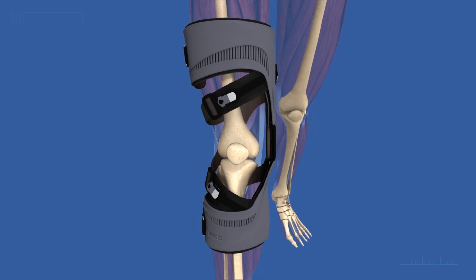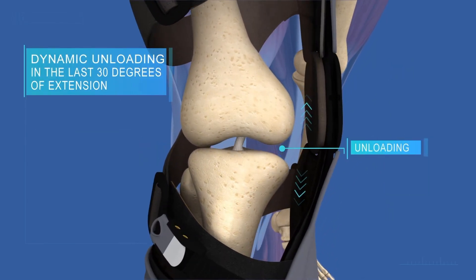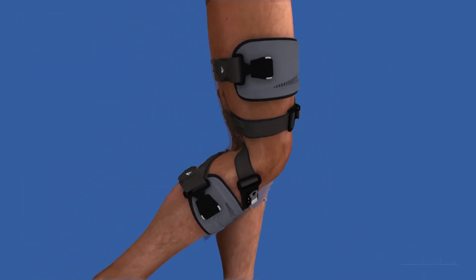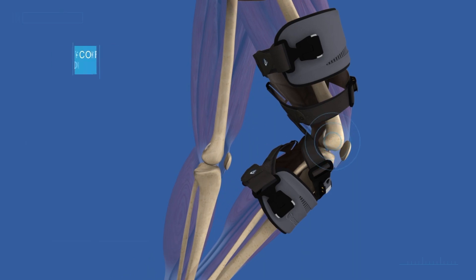Quantum unloads the knee through a dynamic pull system, applying a corrective force in the last 30 degrees of extension when the symptoms of OA are the most severe. Then, as the patient goes into flexion, the load is removed, improving comfort for all-day wear.